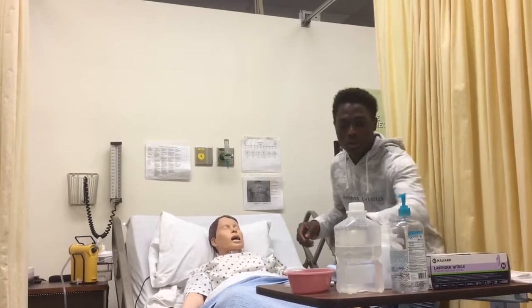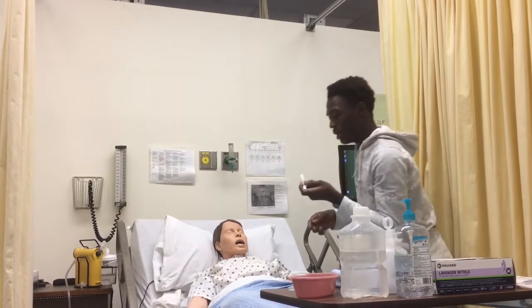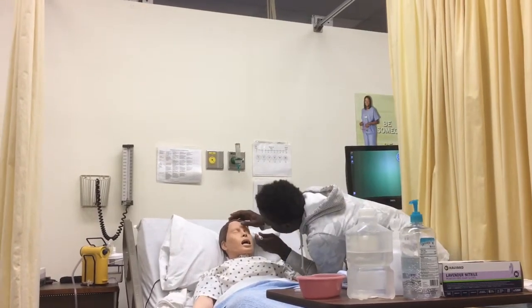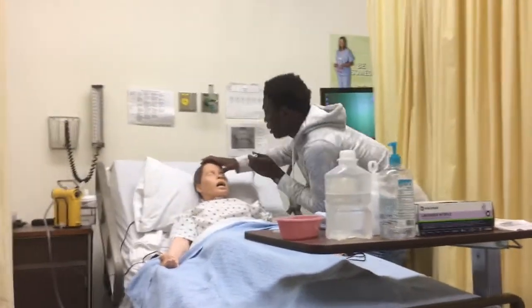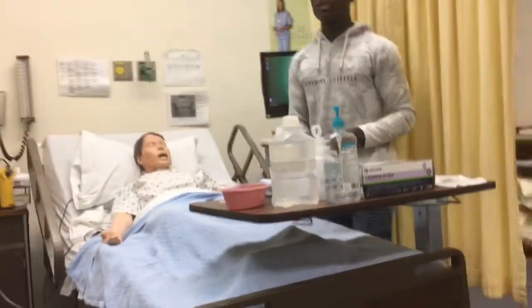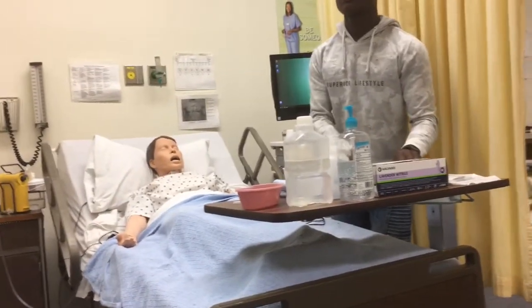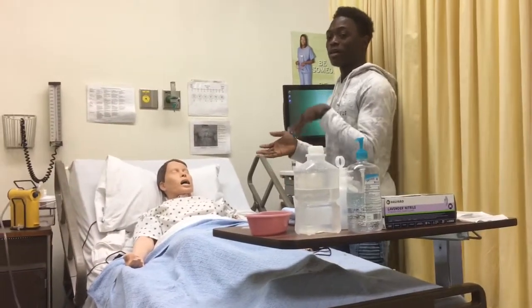To do that, you can use a light pen and identify the area. Okay. So I'm going to use my left nares. But anatomically speaking, the right nares is larger than the left nares. But there are some indications that can affect this procedure.